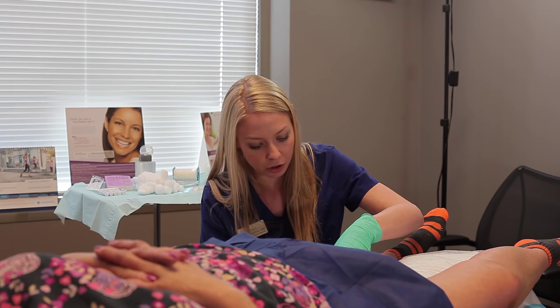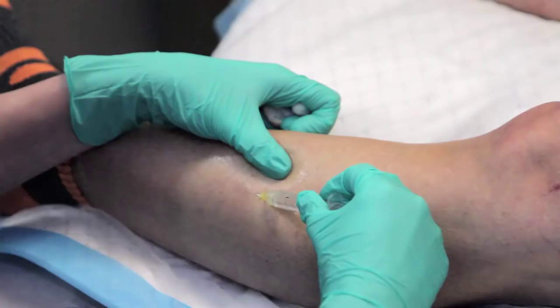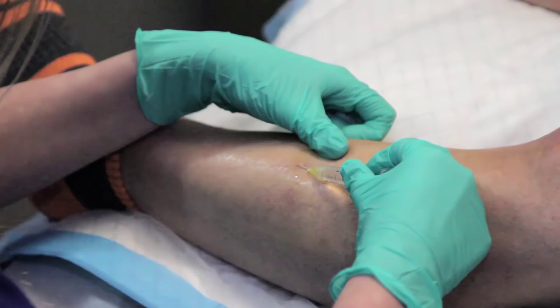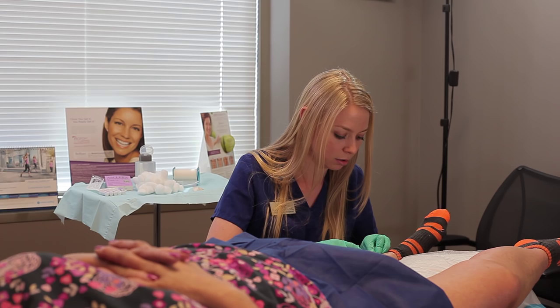Because she does have spider veins already over her legs, she's more prone to them, so she may develop spider veins in other areas — this is just something she'll want to keep up on over time. People find it's a lot easier to do these treatments through the fall so that they don't have to wear compression stockings when it's very warm outside, and also avoiding the sun in the summer can be hard to do.